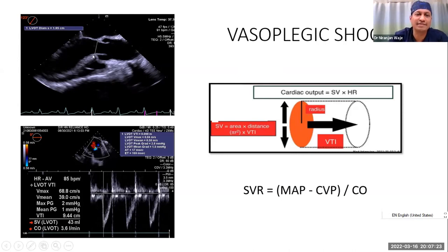The point we decide on is the LVOT. This is a mid-esophageal long axis view. This is the LA, LV, mitral and aortic valves. These views are almost the standard views, so you don't need to know all the views. Basic 4 or 5 views can bail us out of many situations. This is the standard mid-esophageal long axis view.